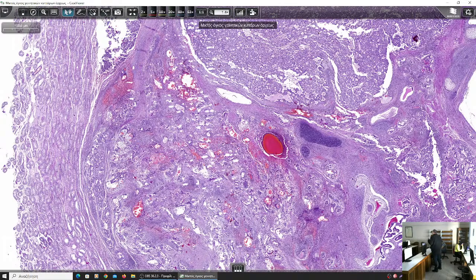Not like those which are secreted by single syncytiotrophoblastic cells dispersed throughout the tumor, which can be encountered in any type of germ cell tumor. A seminoma can have such cells. An embryonic carcinoma can have some such separate syncytiotrophoblastic cells. Yes, please. You said not overdiagnose?